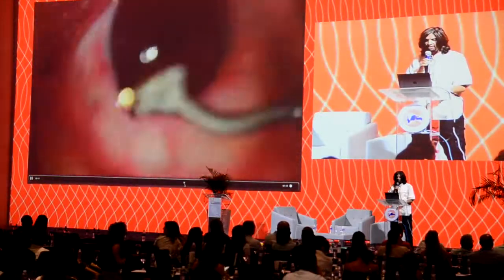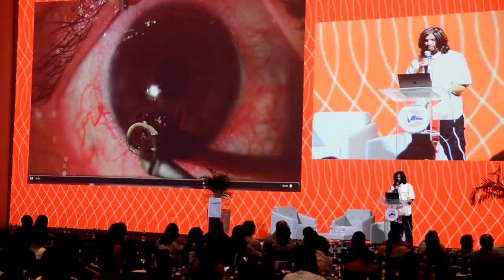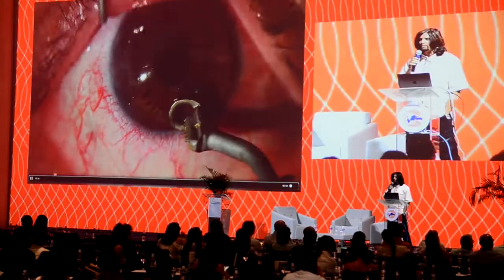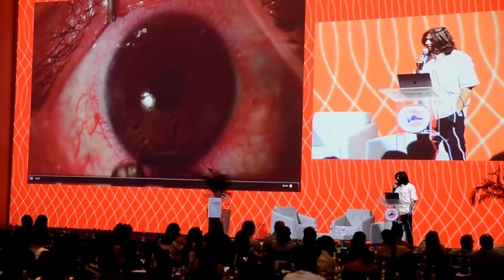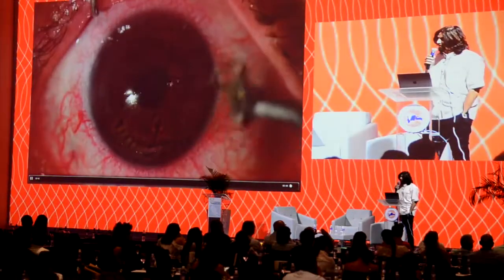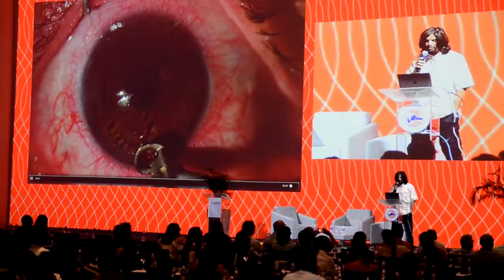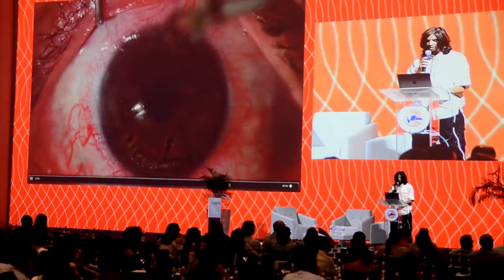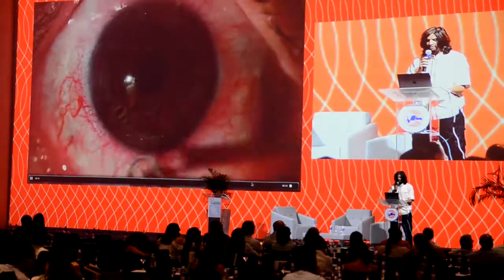And then we can proceed with this speculum. There's the blade. We basically perform the arcuate incision at the slit lamp. It's pretty amazing what we do at the slit lamp. We inject in the eye, we suture on the eye, we make cuts on the eye like this, we remove foreign bodies, go into synechiolysis even. And so we do these arcs. This was about 45 degrees.